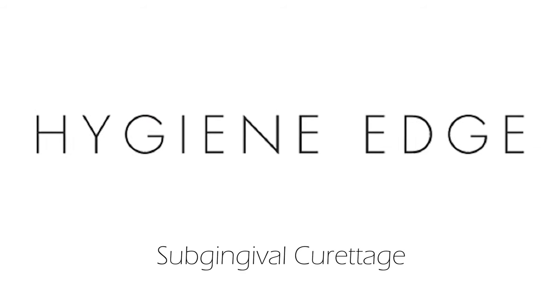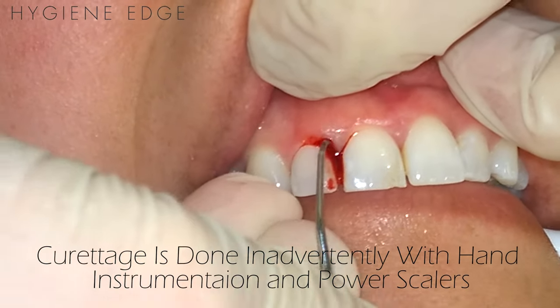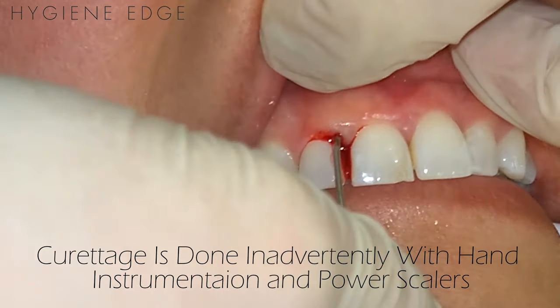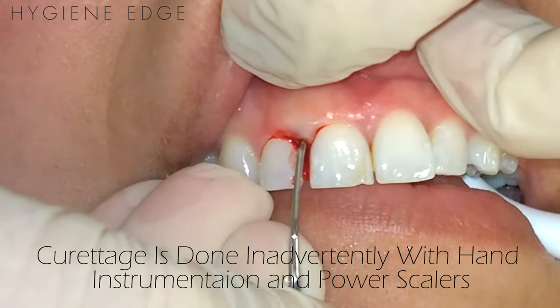Subgingival curettage is inadvertently done with our hand instruments and power scalers, thus it's a procedure that is no longer routinely performed. The purpose of curettage is to remove the necrotic, chronically inflamed granulation tissue from the lateral wall of the sulcus.